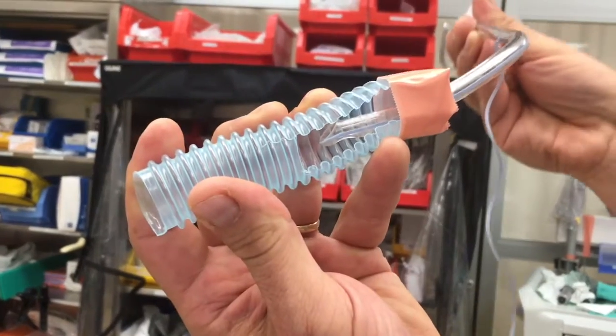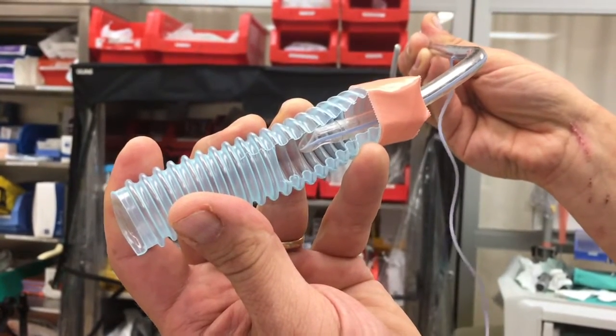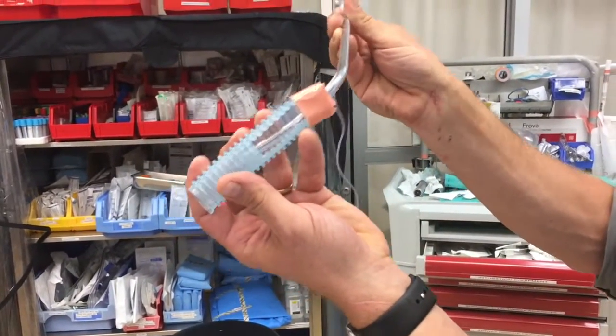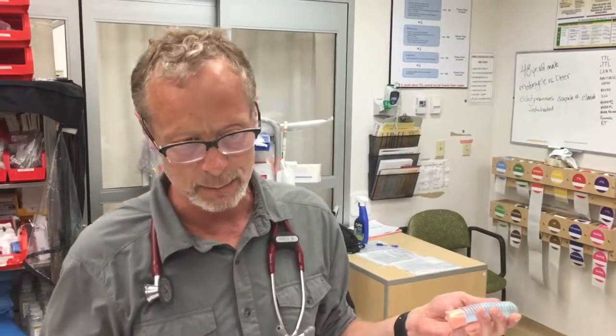Sometimes it still will be caught. The next corrective maneuver is to move to the right — drop it to the bed. What that does is make the open face of the bevel go up, which takes the leading edge of the tube off the rings and directs the end of the tracheal tube in the long axis of the trachea, so you can push it down. So the message is: if you're proximal to the glottic inlet with a bougie or scope, rotate left. If you're through the glottic inlet, pull back the stylet two to three centimeters and then drop it to the right, which takes the bevel off the tracheal rings and orients the distal end of the tube in the long axis of the trachea.